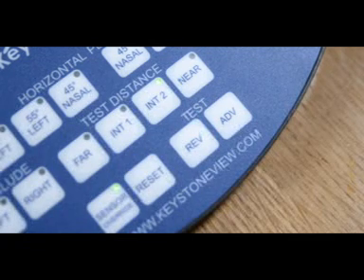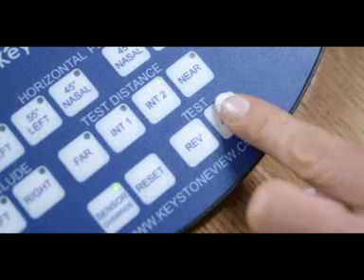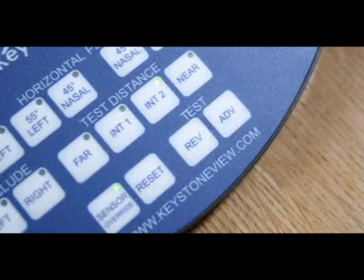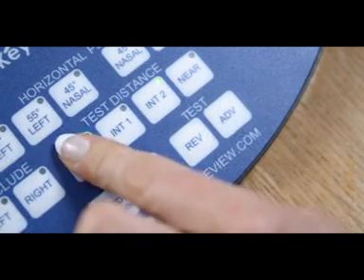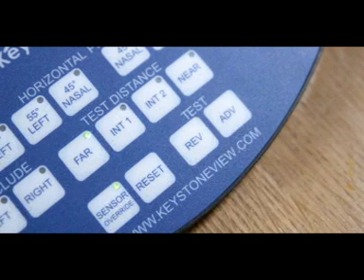Now press the ADVANCE key to move on to test 5. You will also need to press the FAR key on the control panel. Begin by asking the participant whether they can see a scale of numbers and dots with two cross lines running through it. There are now two questions to ask about this scale.